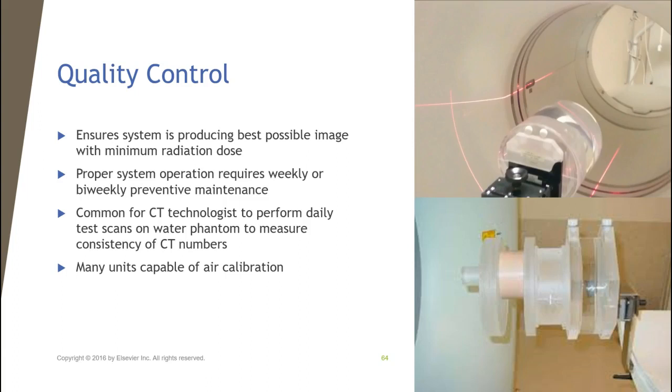Okay, the CT tech comes in and fires up the machine, landmarks on the CT phantom exactly on the crosshairs where it's supposed to landmark, and there's a protocol for QC set up where it takes 3 images at certain intervals. The CT tech then can look real quick through those images to make sure that there are no ring artifacts, no streak artifacts that they see, and to make sure that they can count the spokes and the line pairs like in those images that we saw previously, to make sure that everything's working the way it should. And if not, call the appropriate engineer or physicist.